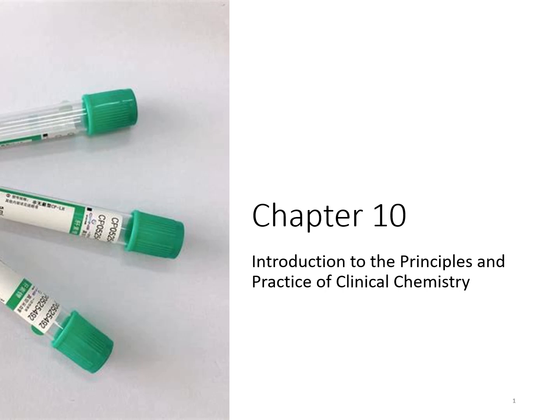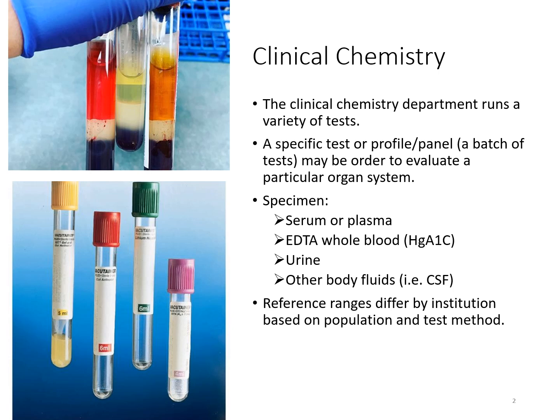This lecture will cover Chapter 10, An Introduction to the Principles and Practice of Clinical Chemistry. The clinical chemistry department runs a variety of tests. Depending on the size of the lab, the patient population they serve, or the physicians that they serve, will depend on which tests they offer within that laboratory department. It could be just a few simple tests if it's a smaller physician's office lab, or if it's something like a hospital lab, you could have a wider variety of tests.